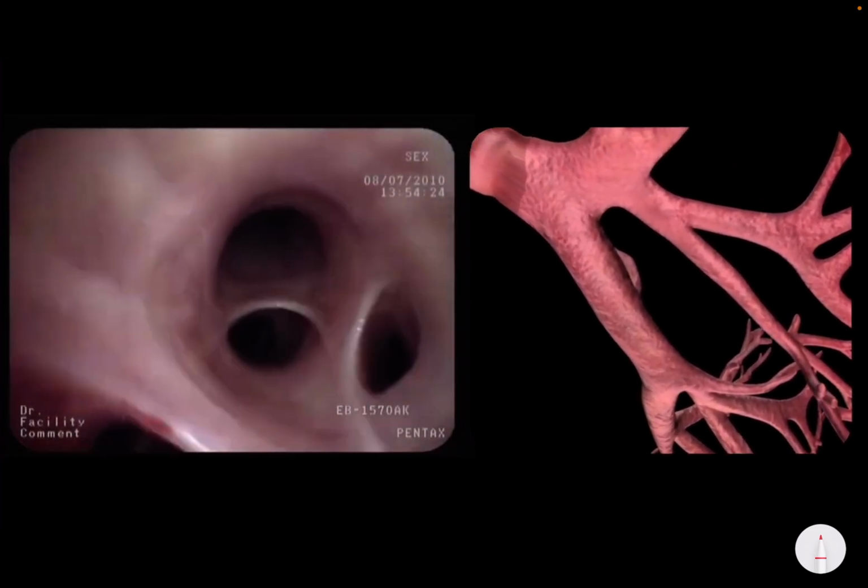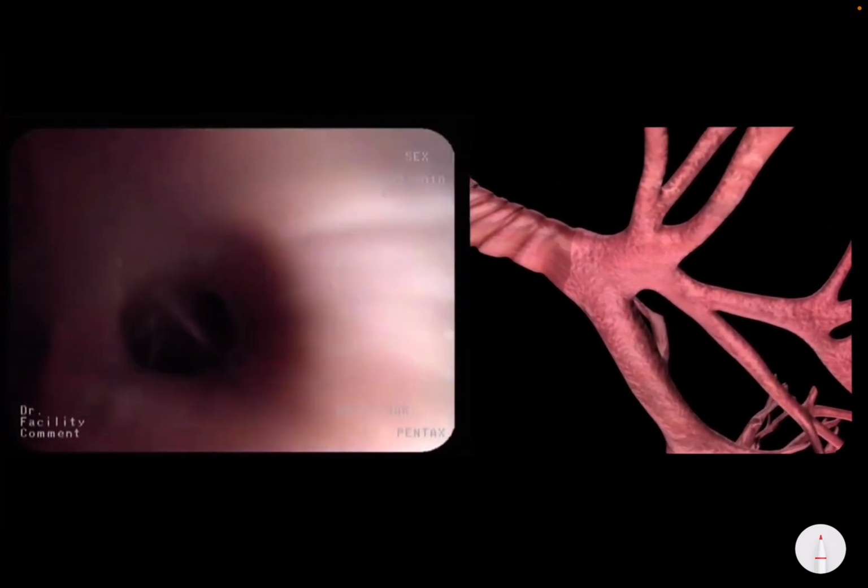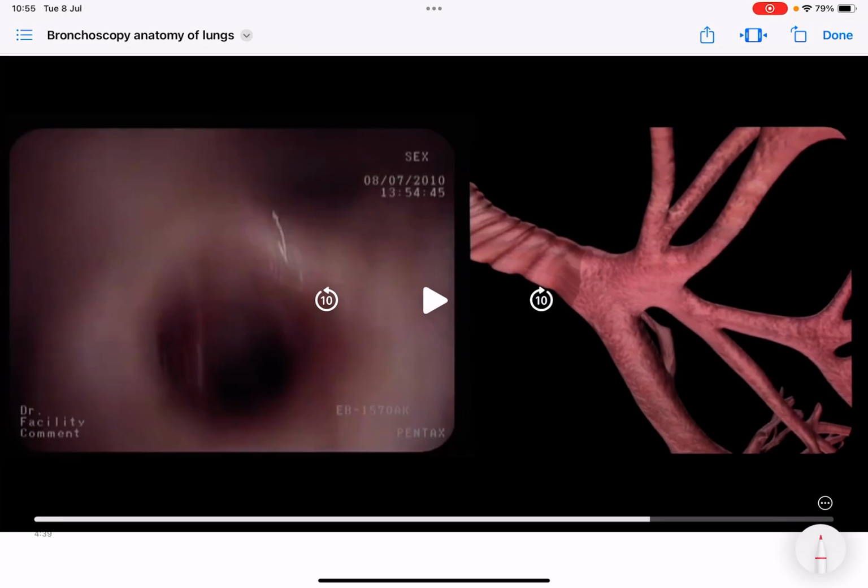Now we draw the bronchoscope back to see how the left upper anatomy is different from that of the right upper anatomy. We know that the right upper anatomy is further divided into three parts: apical, anterior, posterior. But on the left side, it is first divided in two parts: the lingular segment and the left upper proper division. And on further advance in the left upper proper division, we see two structures separating. One is apico-posterior, LB1 plus 2, and LB3 is anterior. And when further advanced into the left apico-posterior, it is further divided into two. LB1 is apical, LB2 is posterior.